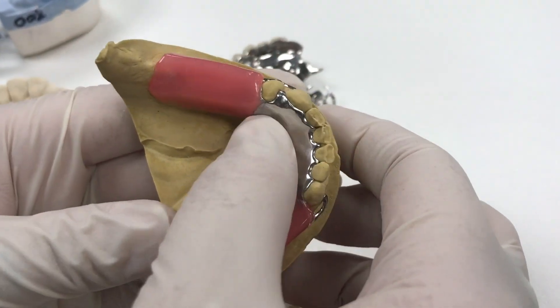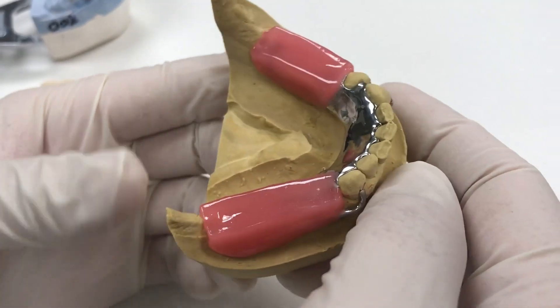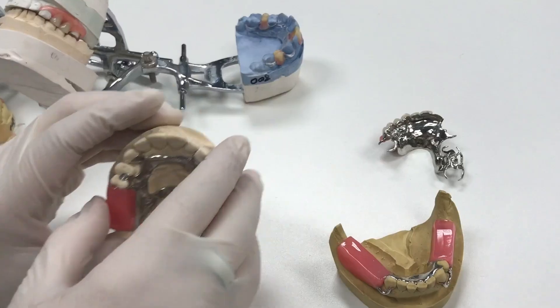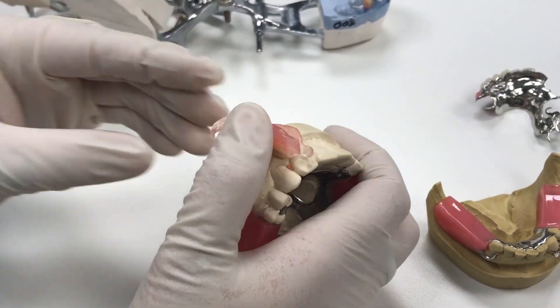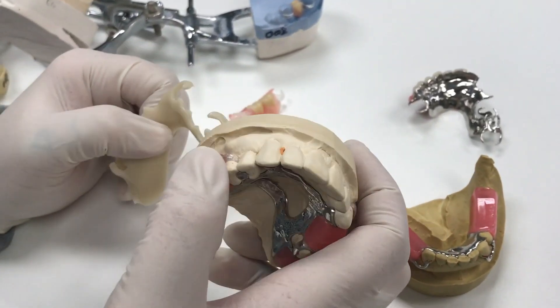There's also a lingual plate and we can do lingual bars — the designs are pretty endless. We can do a lot of combinations, and with all of our cast metal partials we can do clear clasping, pink clasping, and tooth-colored injected clasping on all of our partials.